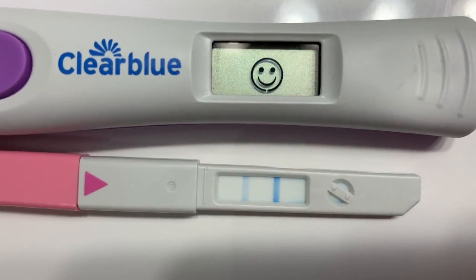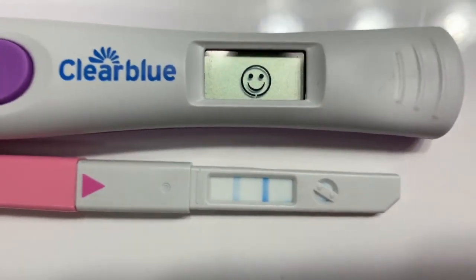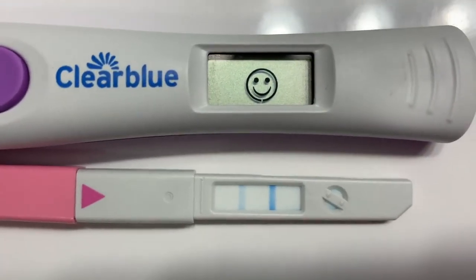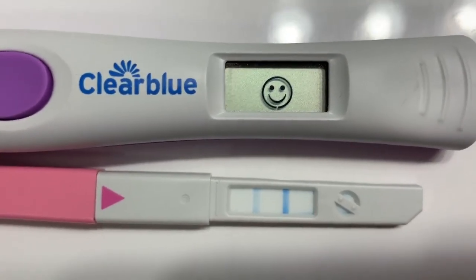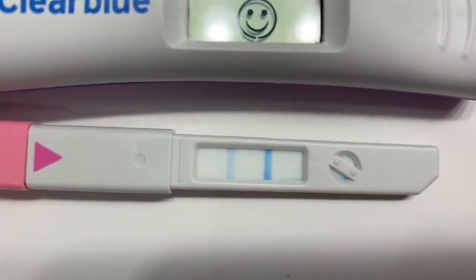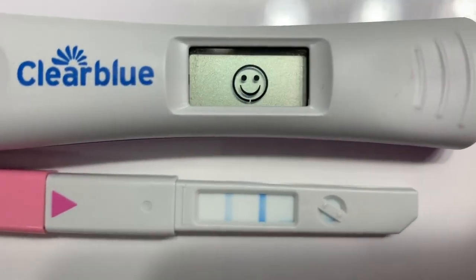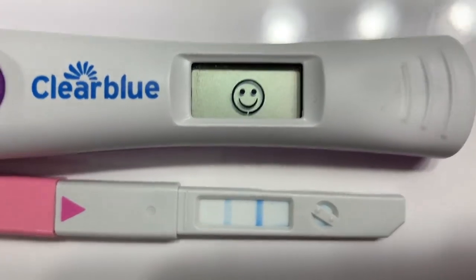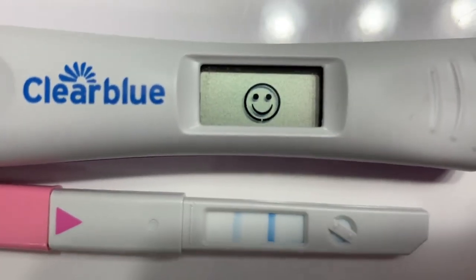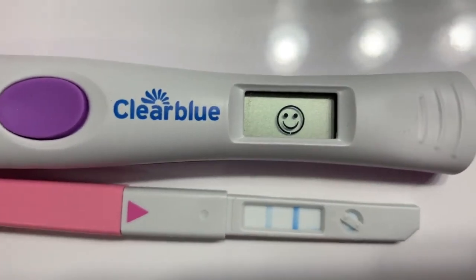And my urine was pretty concentrated. That's another thing. I thought it was going to be flashing because I'm a little dehydrated tonight, which is not good, and I need to drink a ton of water. So, oh my gosh. Here's the thing. First morning urine tomorrow, I should still have a positive, and I bet the lines will totally match tomorrow. But either way, the surge is on.